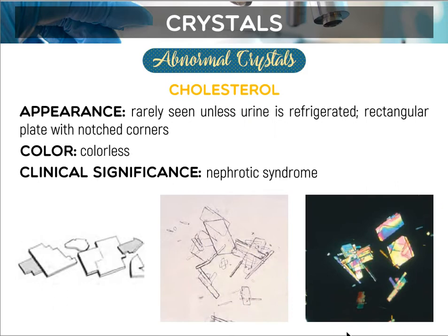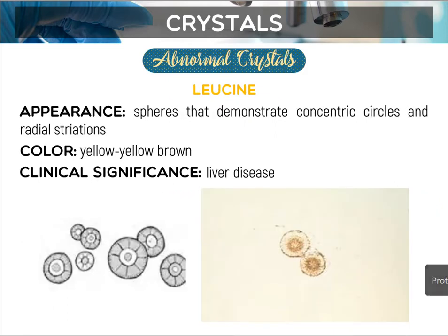So one thing to take note na. Okay, kay atong cholesterol man good na crystal seen in conjunction with fatty acids and oval fat bodies, di ba? Sila ang significance man pud nilang duha kay ang nephrotic syndrome. Alright? Next, we have your liver disorders. And then makita nato ni sila na mga crystals dito. Tulo ni sila guys, si leucine, si tyrosine, o si bilirubin. Tulo na sila guys, okay? If naa ni sila, automatic positive ang chemical reaction sa bilirubin, okay?